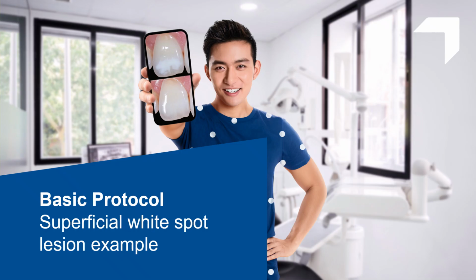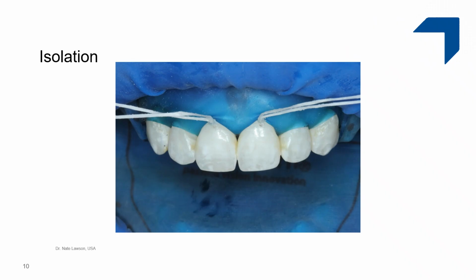For this example, we'll review the ICON resin infiltration treatment steps for a superficial white spot lesion located close to the enamel surface. Clean the affected tooth and adjacent teeth, then remove any cleaning with water spray. Then apply a rubber dam or liquid rubber dam. A key component of successful treatment is to maintain a dry working field.